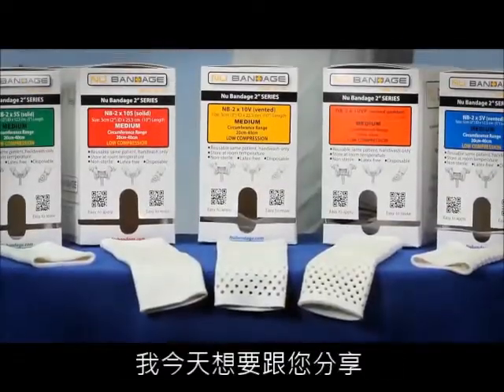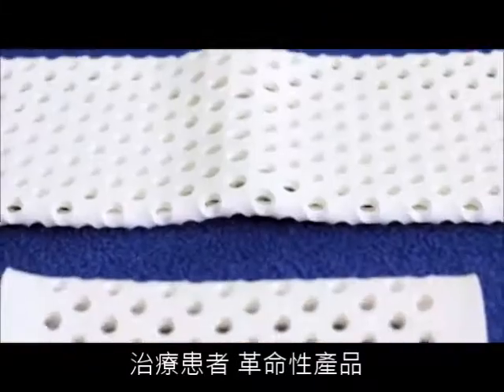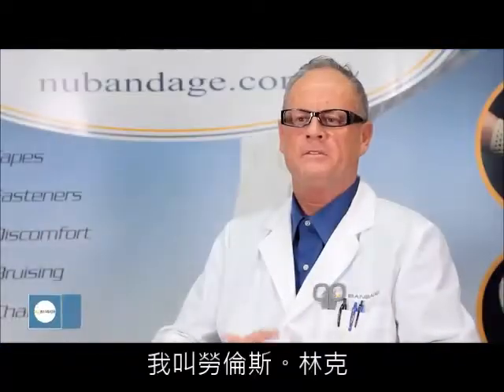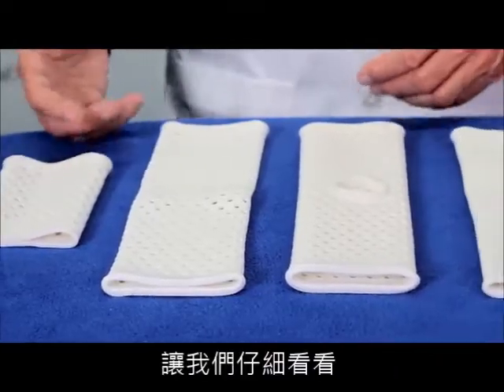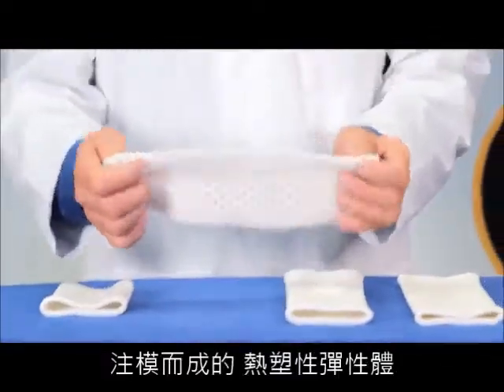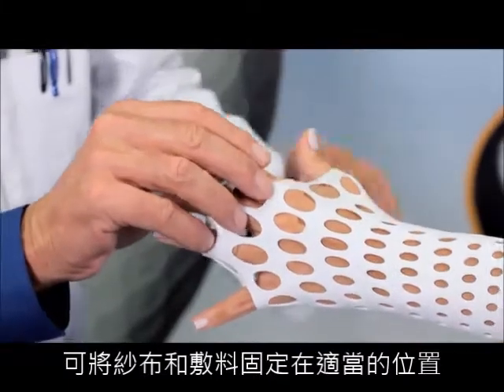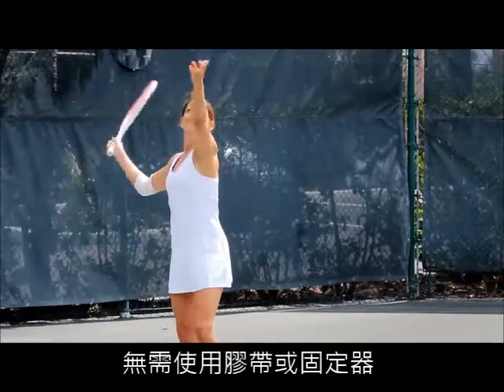I'd like to share with you today new and exciting technology in wound care and a revolutionary way for you to treat your patients. My name is Lawrence Reinke, inventor at Nu Bandage Technology. Nu Bandage is a one-piece, mold-injected, thermoplastic elastomer that holds sub-bandages and other medical devices in place without the use of tapes, adhesives, or fasteners.